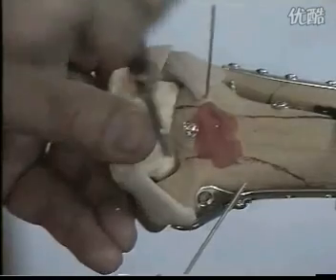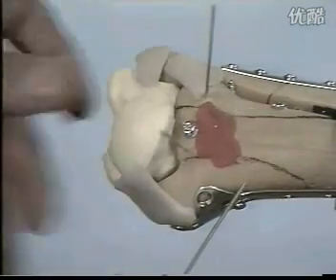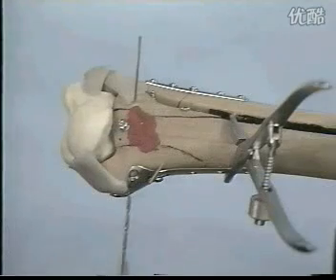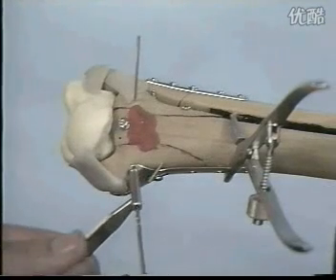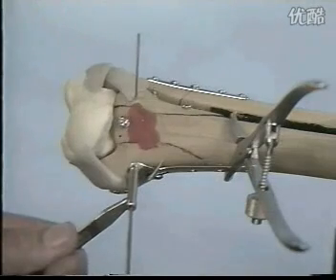The talus glides on a smooth joint surface. Now we insert the remaining plate screws. Distally, we plan to use cancellous screws with lag effect because they cross the fracture lines.